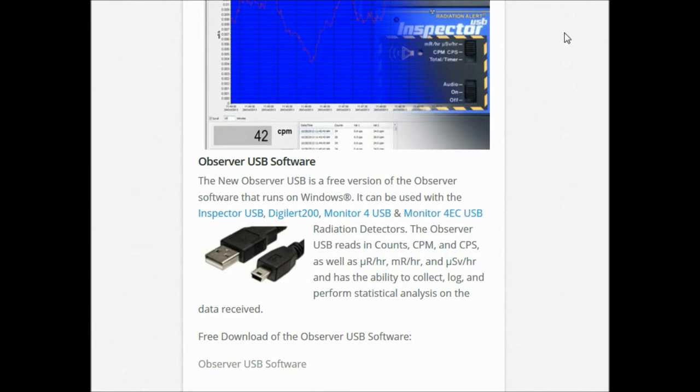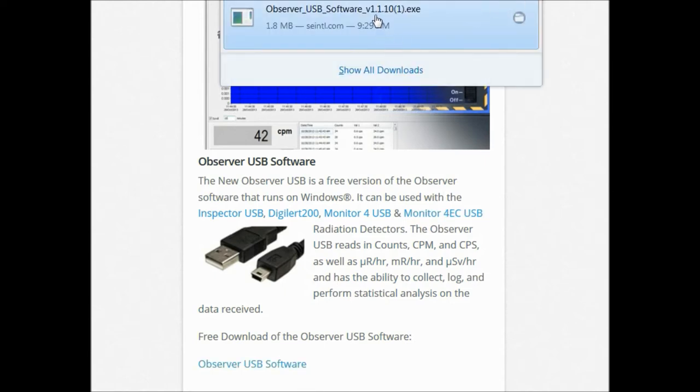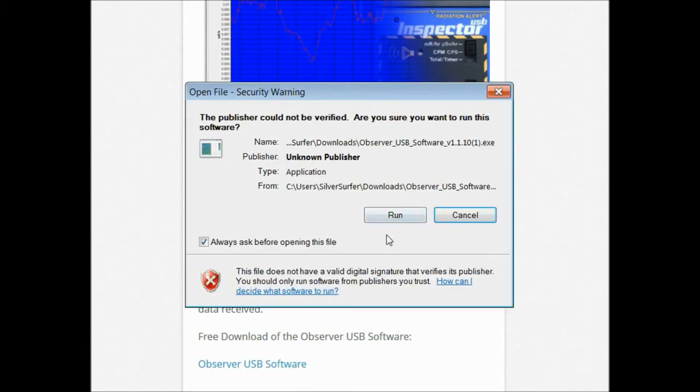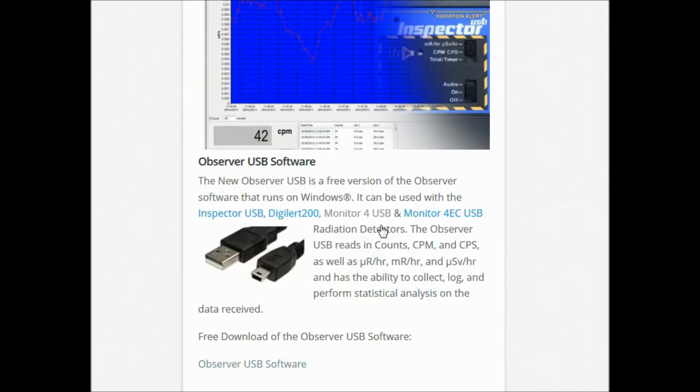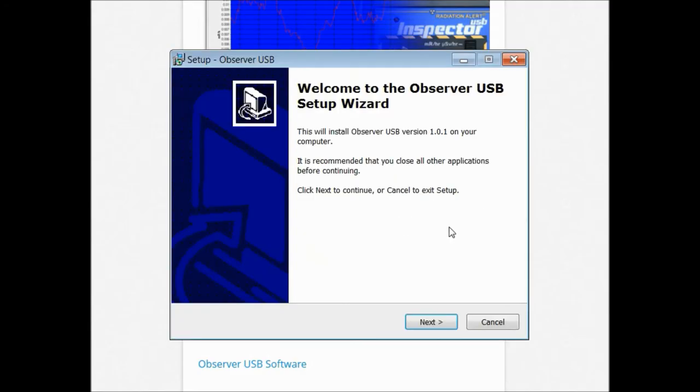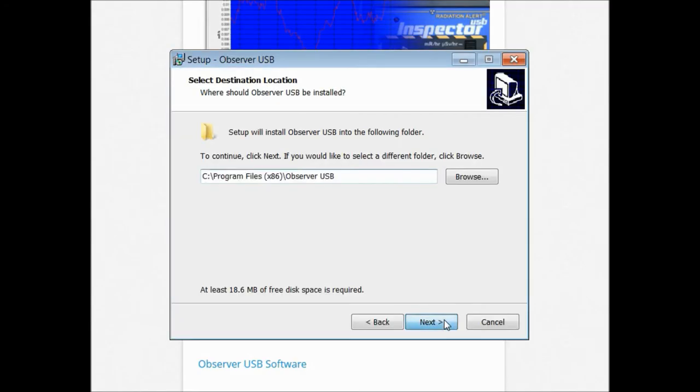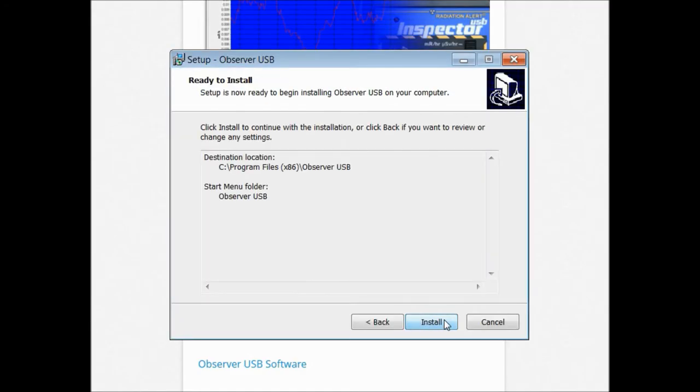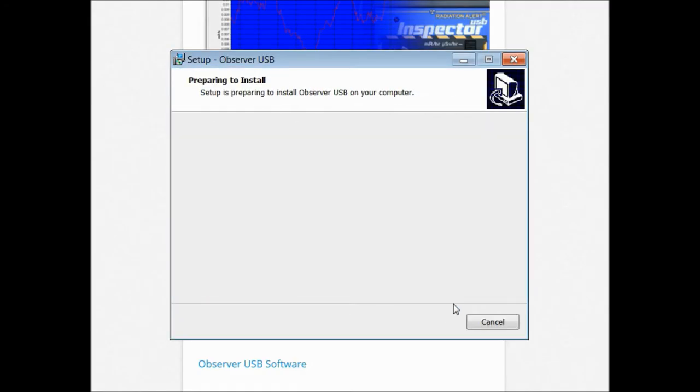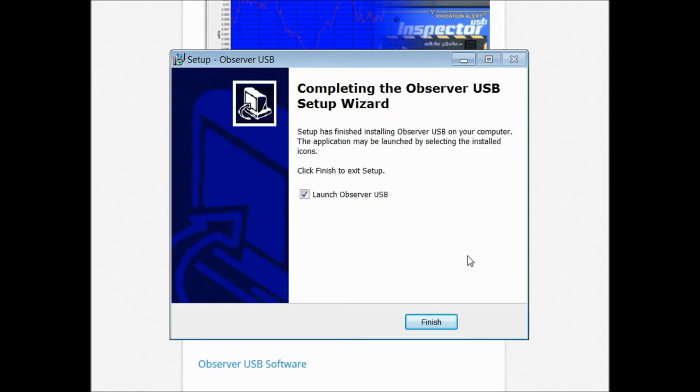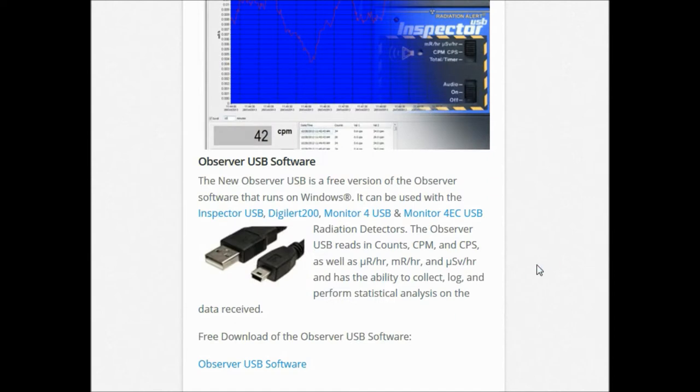Once the file is finished downloading, just click on the installer and get started installing the Observer USB software onto your computer. Once the install has finished, you'll be prompted to launch the software. Just say yes and hit finish.